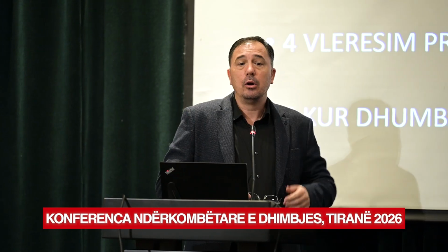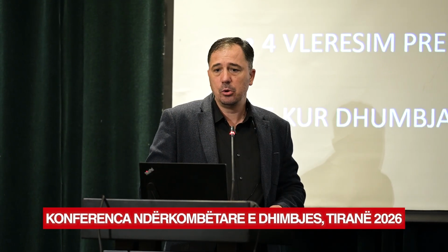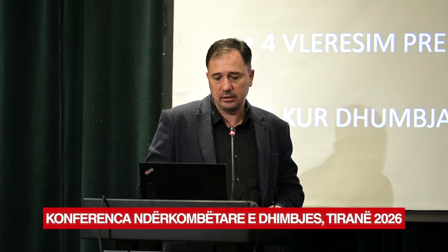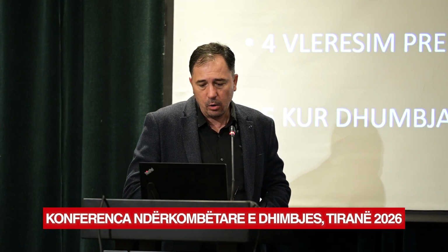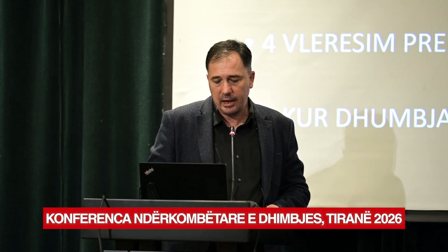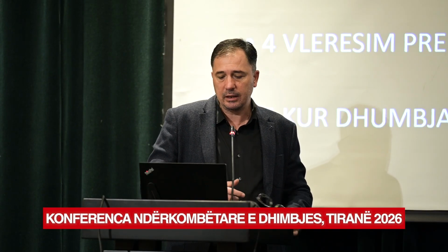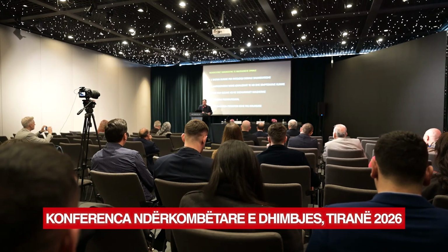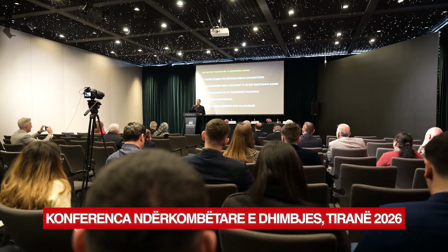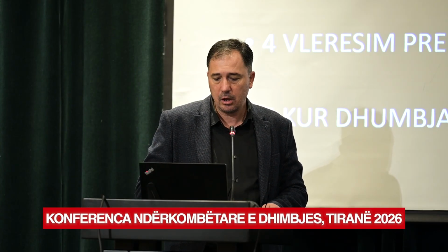So we can use the infiltrations of nerve roots using CT scans for diagnosis, and in these cases maybe the pathology will be at multiple levels. We may have an antagonism between the localization and the clinical symptoms, and in these cases we can use the nerve root infiltration to make the diagnosis.